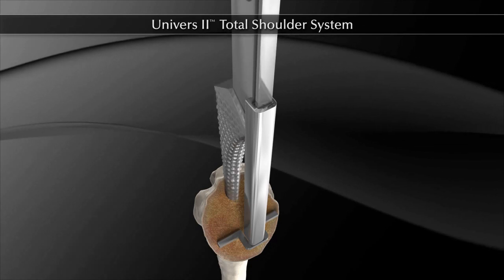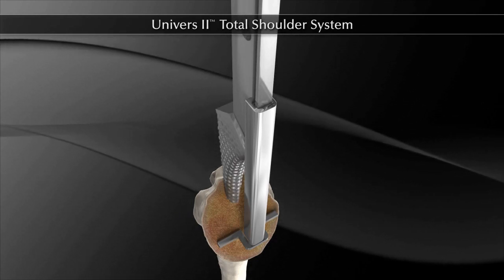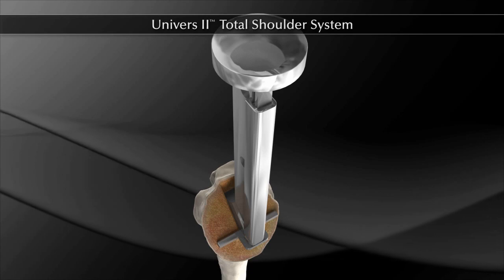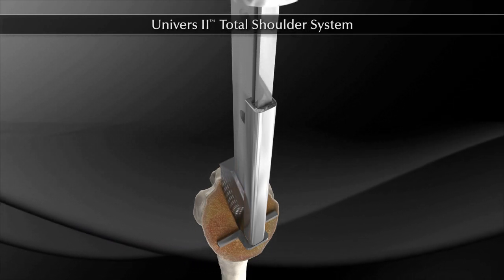The broach alignment guide is positioned onto the 6 mm broach. The broach should be advanced with a mallet until the angled laser mark most parallel to the cut is aligned with the resected surface. The neck size broaches are sequentially used until the appropriate fit is obtained.